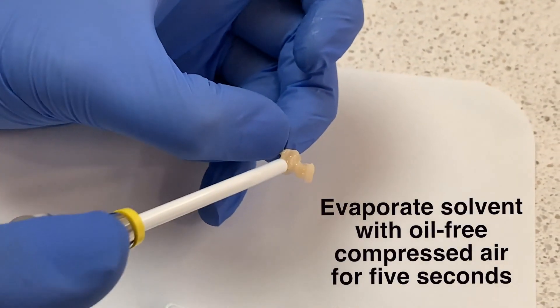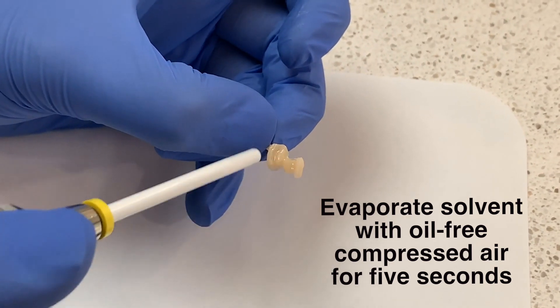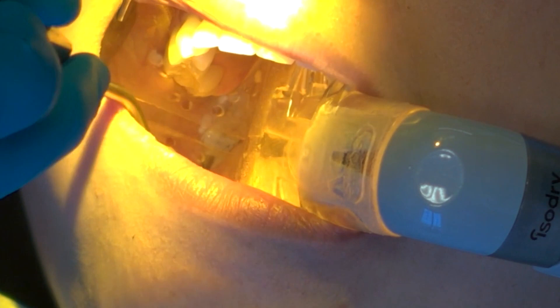After 20 seconds of scrubbing the one coat seven universal, blow gently with oil-free compressed air for five seconds. Now that the internal of the restoration is prepared, prepare the tooth surface for bonding.